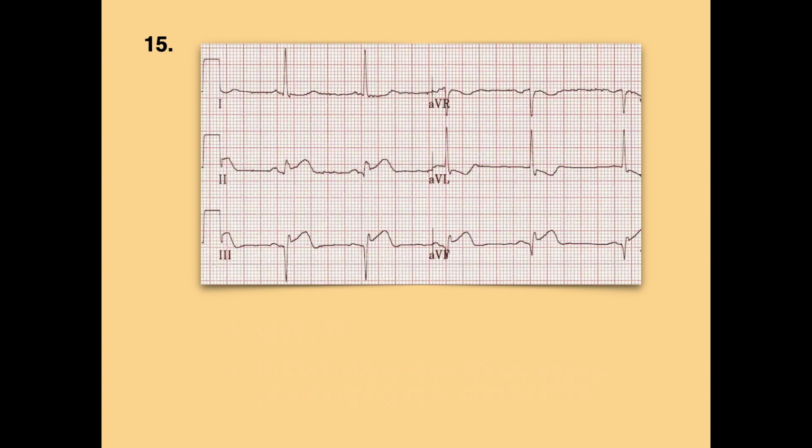Okay, and tell me again, what's your evidence right now of the acute inferior? Because we have ST elevation in 2, 3, and AVF, and then the Q in 3. Okay, so Q's in 3 and AVF, and there's other evidence of that inferior setting. What is it? So you've got ST elevation, you've got reciprocal changes. Yep, reciprocal changes.